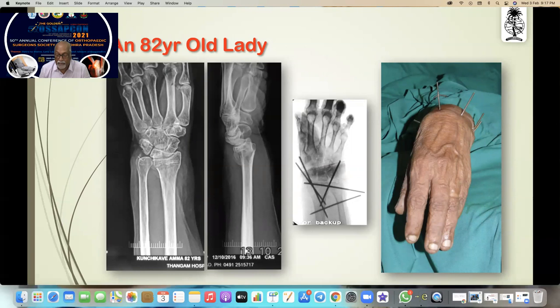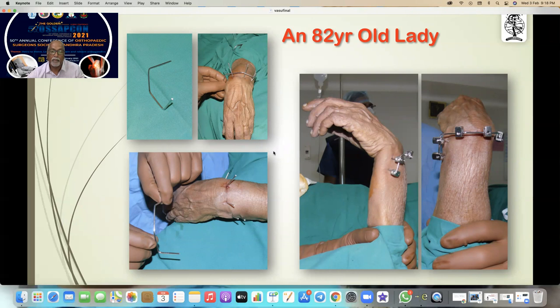You can also use any sort of external fixator. Here you can see a fracture reduced in an 82-year-old lady — the bone was very weak and the stability was insufficient, it was rotating. So I bent the K-wires and connected them together by that bent K-wire.